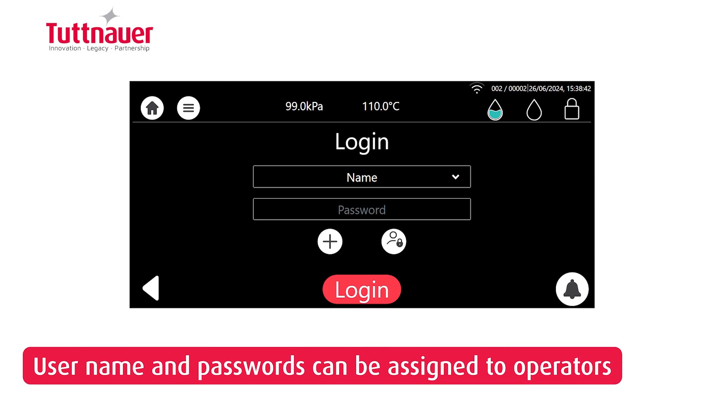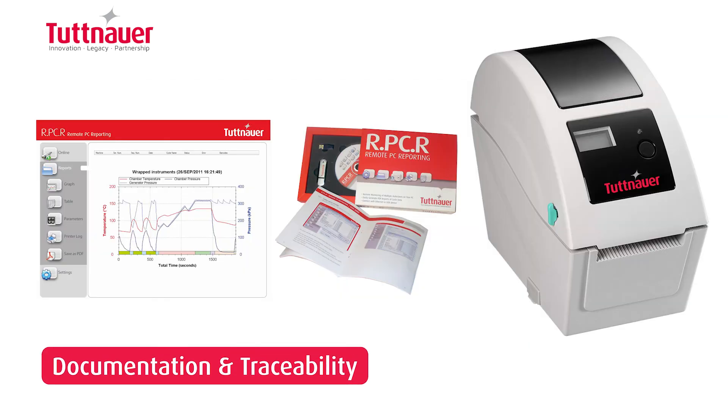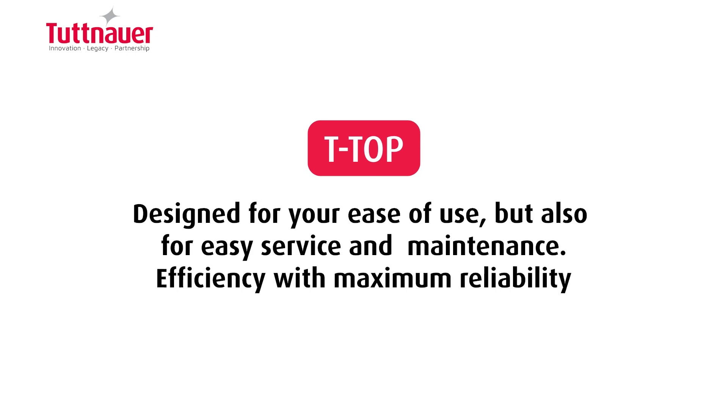User names and passwords can be assigned to operators for monitoring and documenting cycle execution and load release. Label and/or paper printers are available for load tracking, as well as drain kits to simplify water tank management. The T-Top is not only designed for your ease of use, but also for easy service and maintenance.